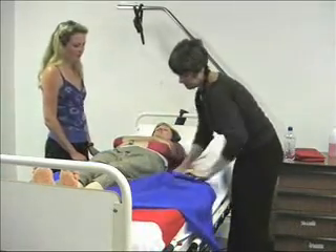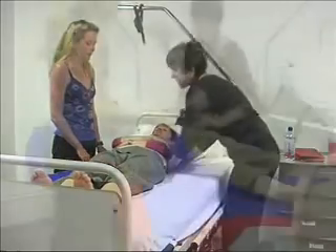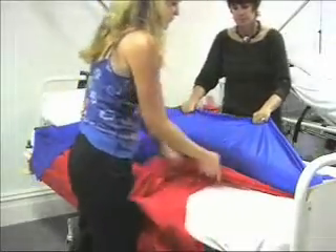Once the patient is in the correct position in the bed, push both slide sheets under the patient as much as possible, then lift the top sheet across the patient, and slide the bottom sheet out.